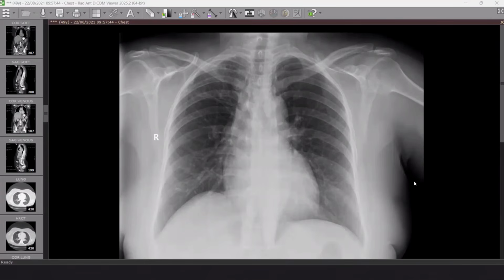In a female patient, with preserved lung volumes and few reticulations in the lung fields bilaterally, more in the right upper zone, I would be concerned that this could represent lymphangioleiomyomatosis, if the patient has a relevant history. Why? Because I see that the lung volumes are largely preserved, and I do not see any regular pattern of disease.